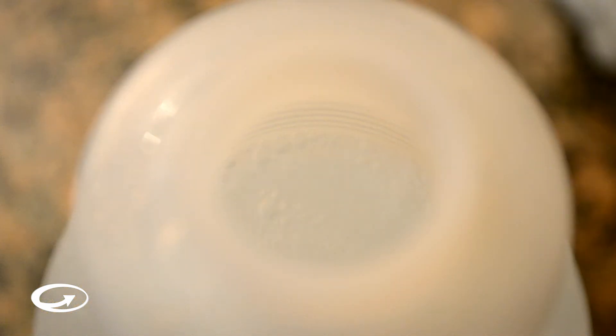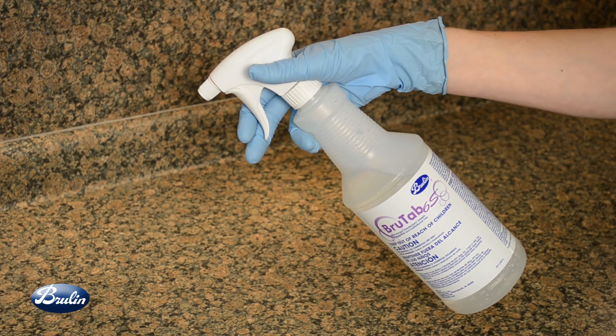Allow the tablets to dissolve in water. Dissolution rate is based on water temperature: two and a half minutes in warm water and five to six minutes in cold water. Use as directed per label directions.